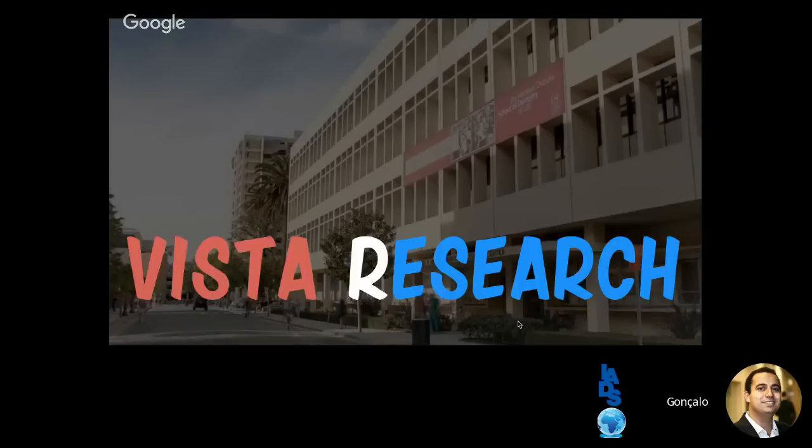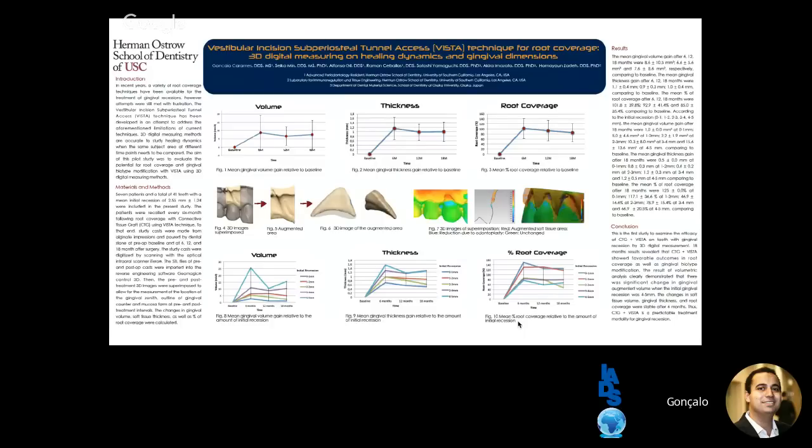So there are also other applications of this technique, the VISTA. We have been doing several studies here at USC. I've been doing several studies as well. So here we have done a comparison of how this technique works in terms of volume, thickness, and root coverage. We use a software called Geomagic, where we basically take impressions of our patients before and after the surgery, usually after 6, 12, 18 months, and even more than that.